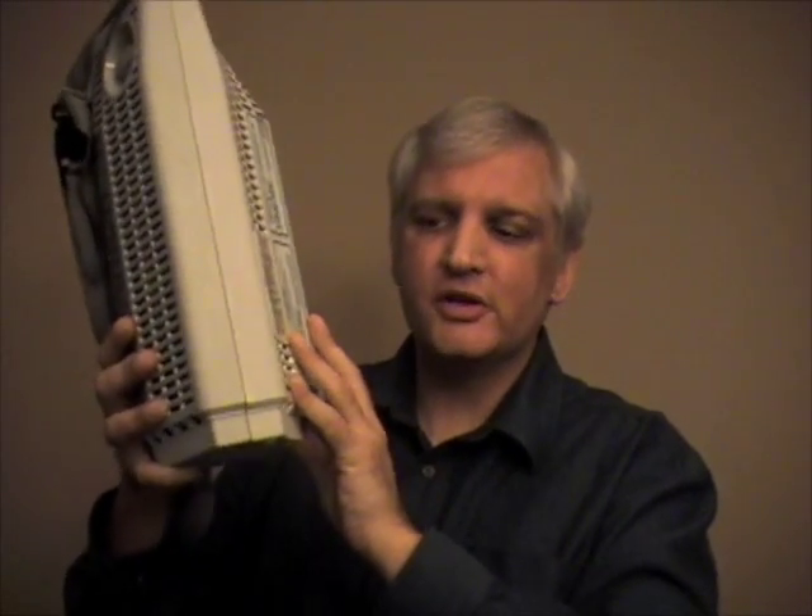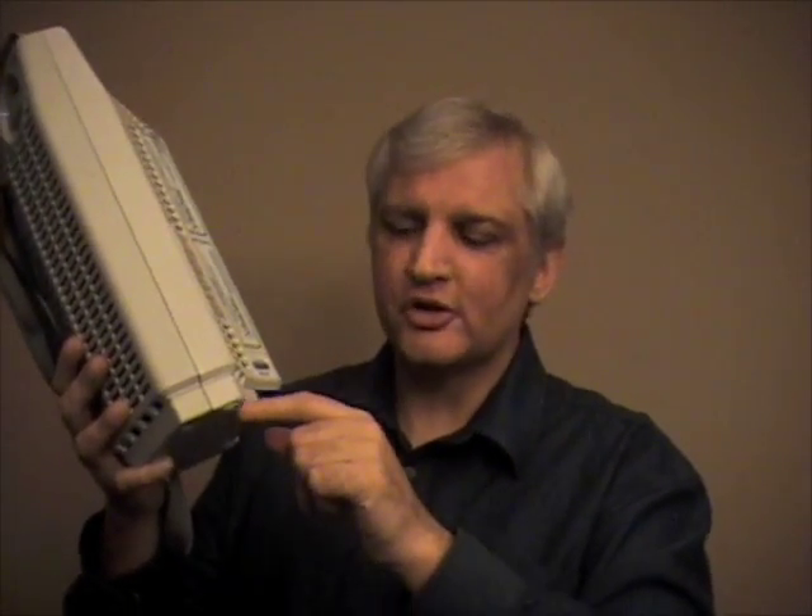I do want to warn you about something. If you're ever filling one of these units and some liquid starts dripping from it, or from the side fill unit, or if you're ever using one of these units and liquid starts dripping from the bottom, do not assume that that liquid is water.